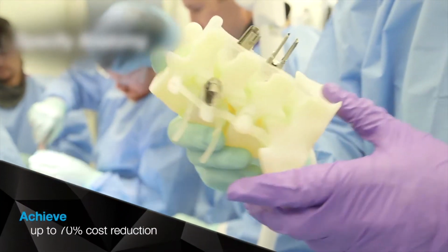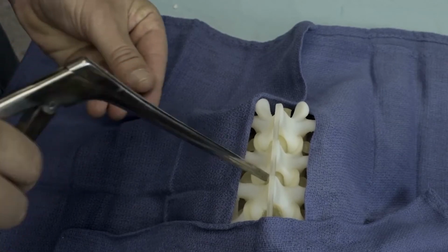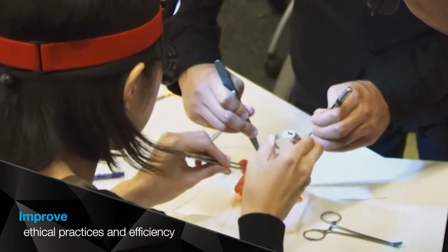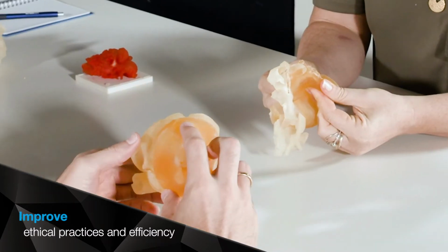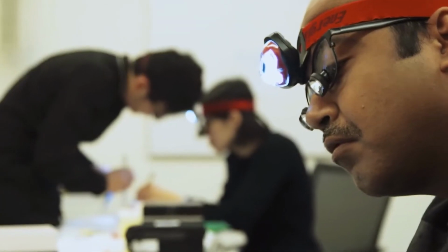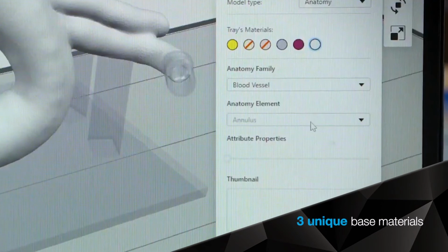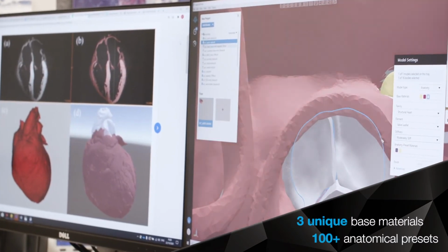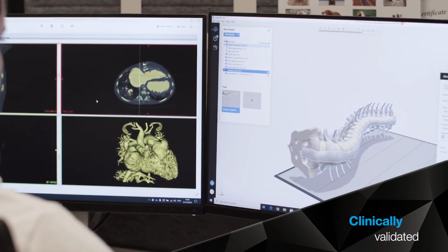Study your patient's anatomy, then plan and execute your approach before ever stepping into an operating room. Reduce the need for cadavers, clean rooms, sterilization of tools, biohazard risk, and other valuable resources. The digital anatomy printer software has a preset anatomy menu with more than 100 options that allow you to print accurate, lifelike models in a few clicks by simply choosing the desired anatomy.